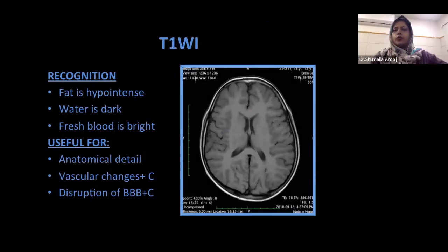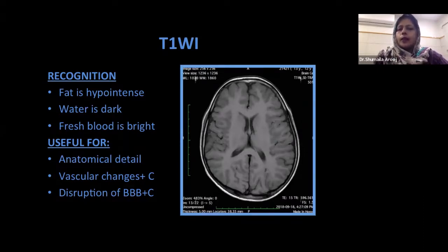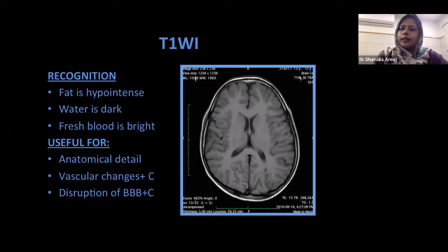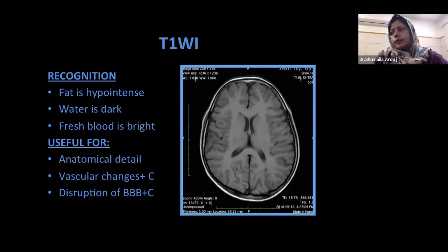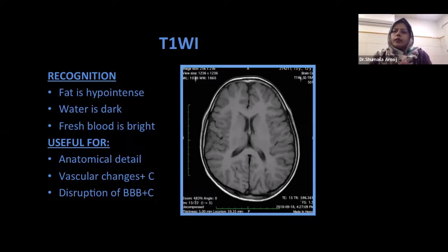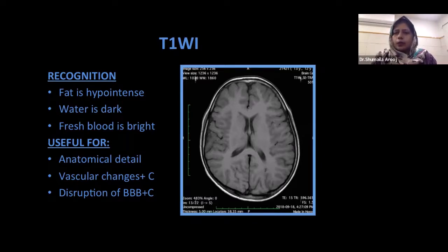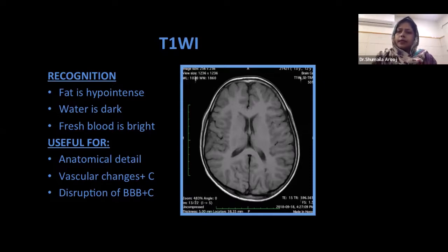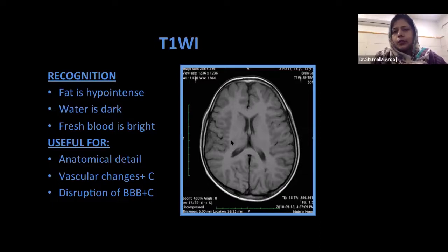T1-weighted images are basically for anatomy. We look at them the same way normal anatomy is: gray matter is gray, white matter is white, and CSF is black. When you look at the peripheries of the brain parenchyma — which is gray matter — that is gray. If the central part is white, the tract-containing part, and the ventricles are black, then this is a T1-weighted image. You then have to decide whether there is any fat suppression or not, as we require fat suppression T1-weighted images in certain situations. T1-weighted images are always useful for anatomical details, vascular changes, and disruption of the blood-brain barrier in post-contrast images.